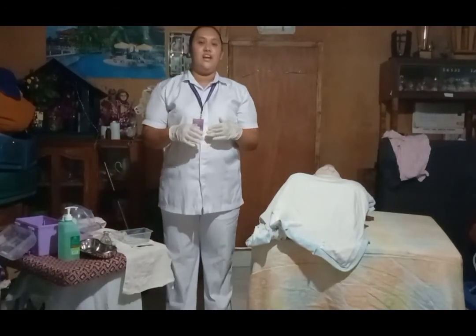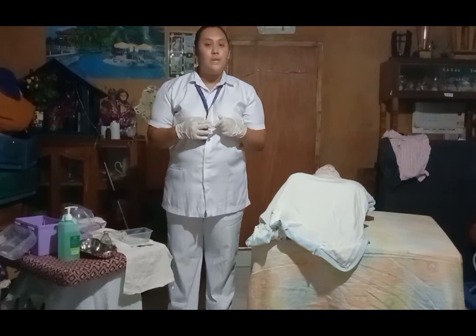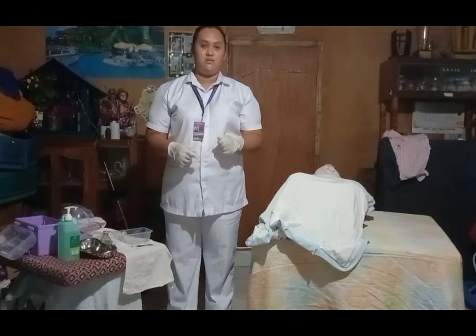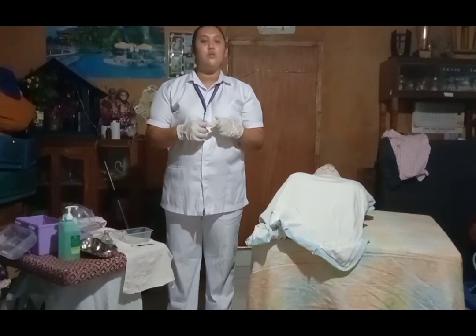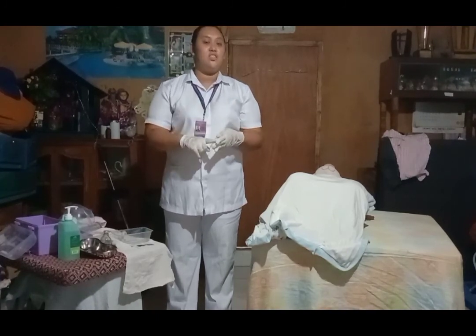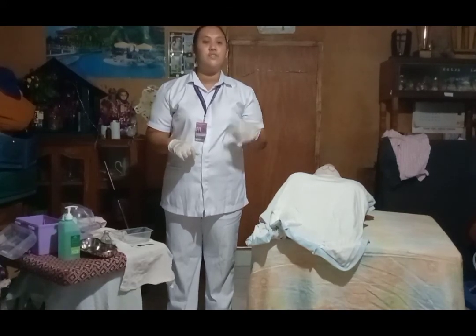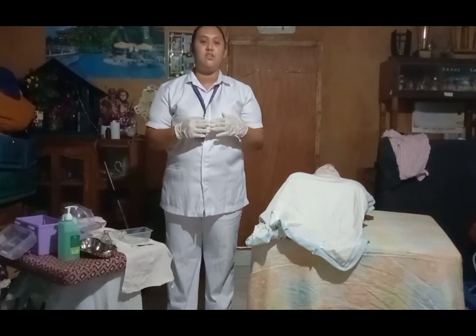Do the aftercare and record the time of the procedure done, the amount, and the color of the initial output. Clean all the equipment used and record the procedure done so that the doctor will know if you have already done the things that needed to be done for the patient. The recording of the urinary catheterization procedure always includes the date, time of the procedure, type and size of the catheter used, the amount of fluid used to inflate the balloon, and lastly the character and amount of the urine, the reaction and response of the patient, and other significant observations.